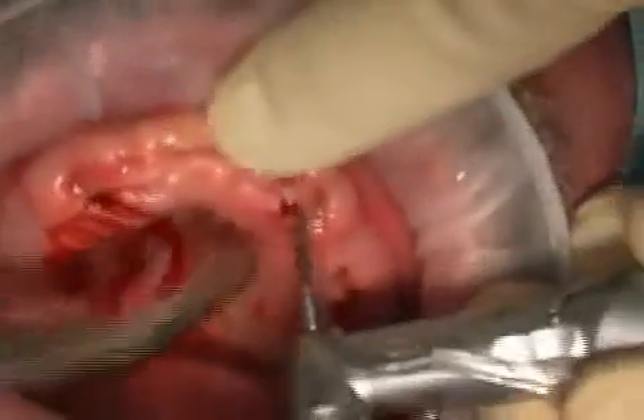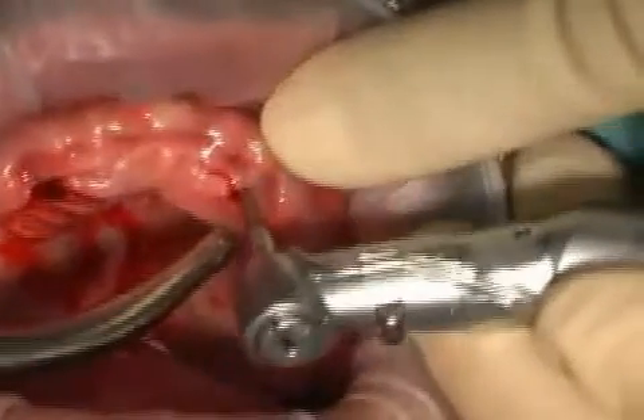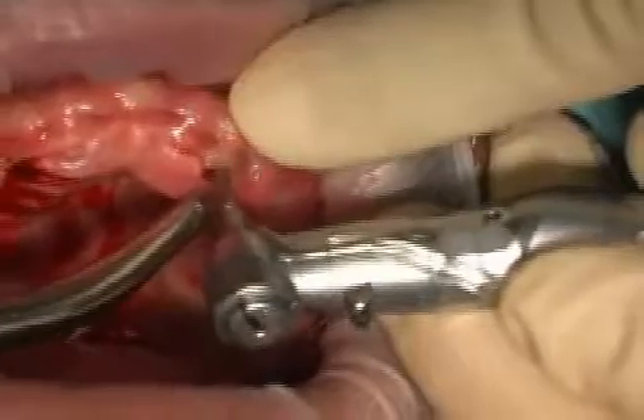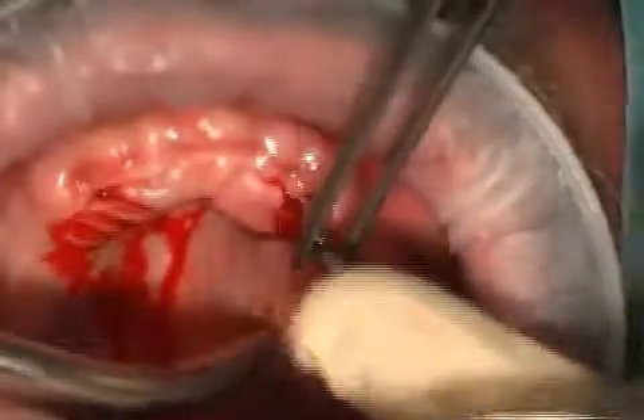Now the pilot drill is performed while being constantly cooled. The drill is gently pushed down — depending on the bone quality, the drill advances more slowly or more quickly. Afterwards, the orientation pin is inserted into the pilot drill hole.